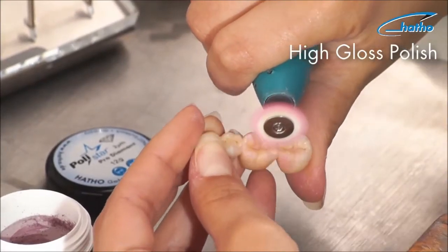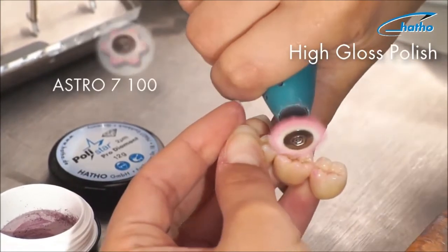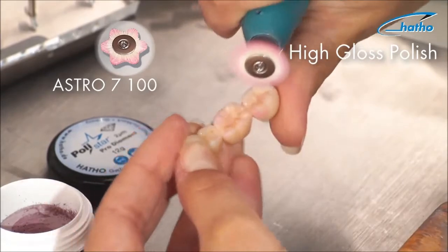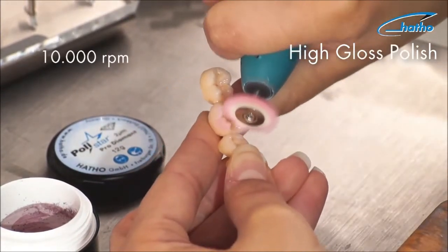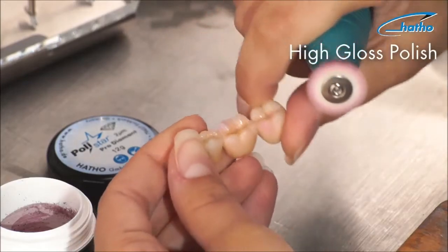Also, to ensure that the deep fissures are reached and polished well, we have developed a star-shaped brush out of fine goat hair. With this astro brush, difficult to reach areas are more accessible, facilitating the polishing process.